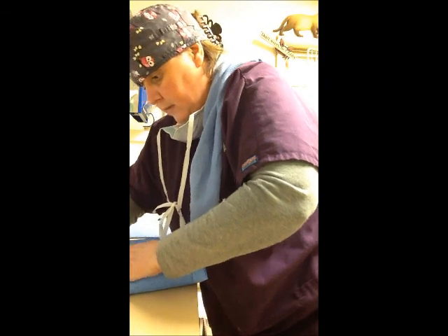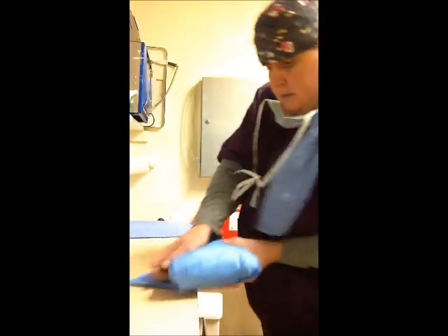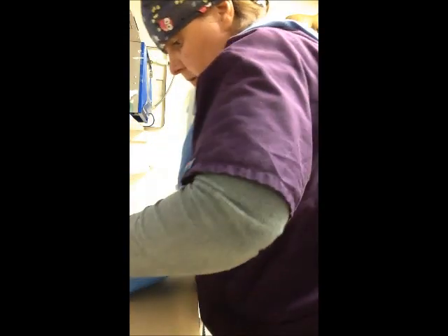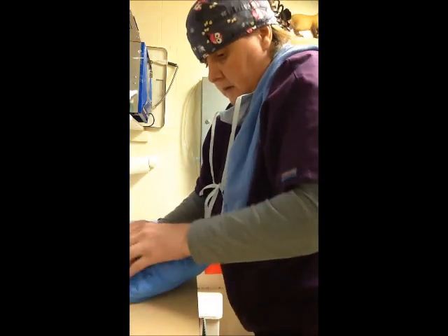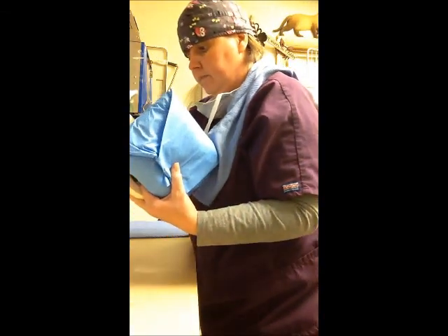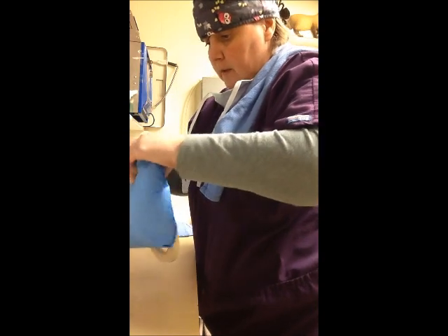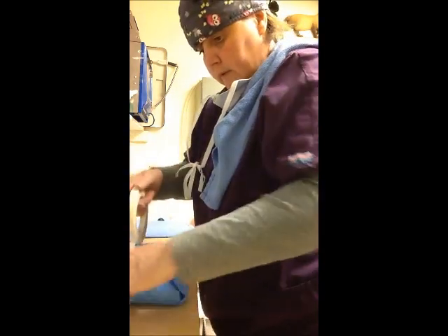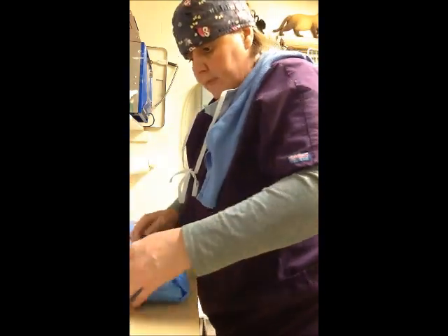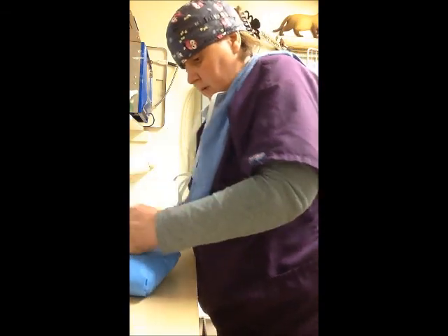Tuck this in and this in. And tuck. I leave it flat in all of my indicator tapes, but in this case you don't need to because the outside is discarded when we open the other wrap.